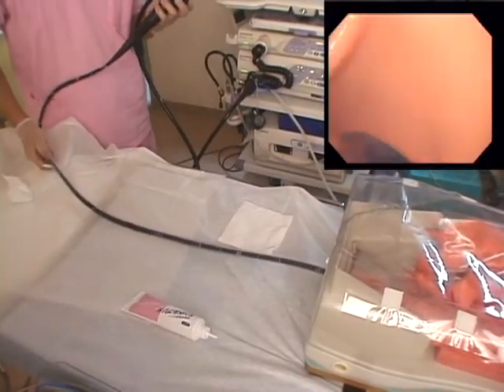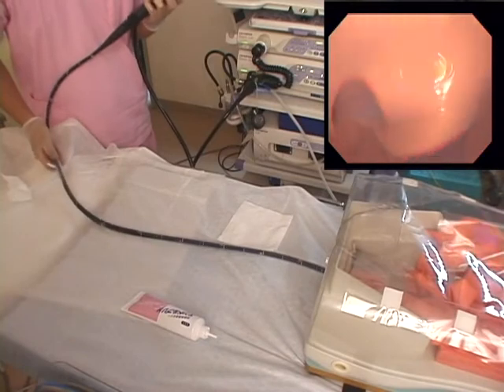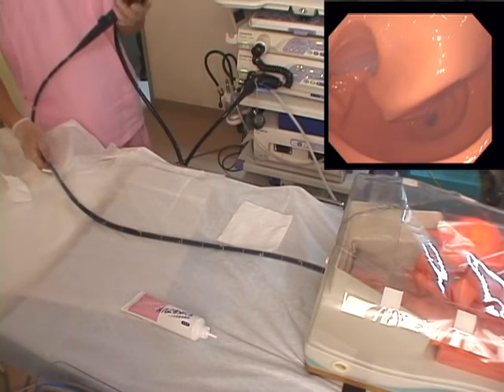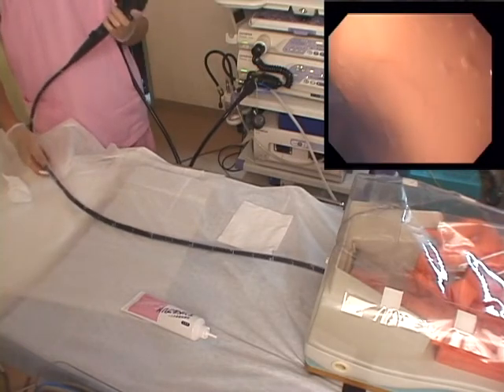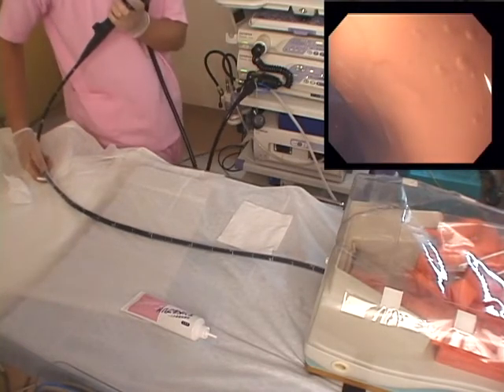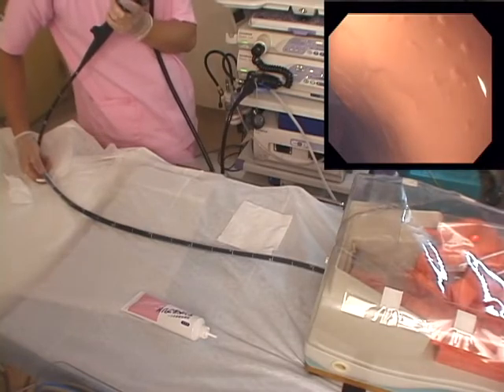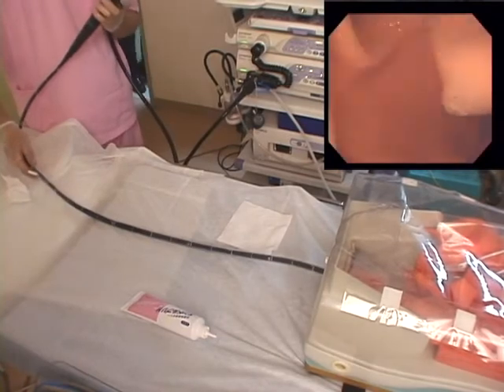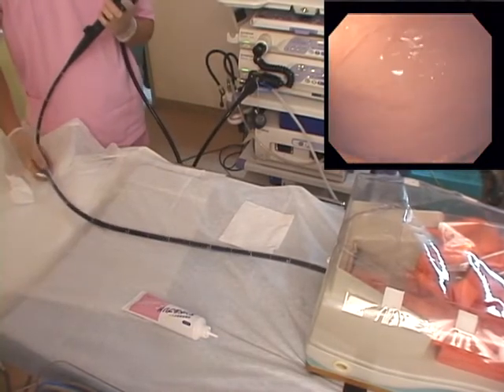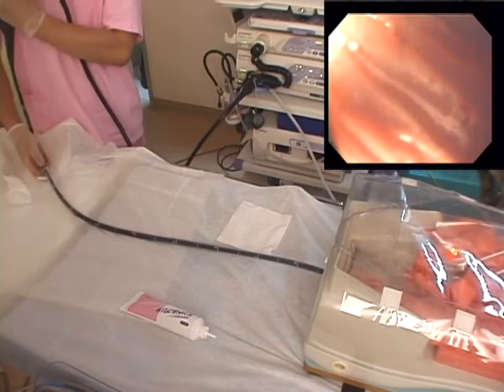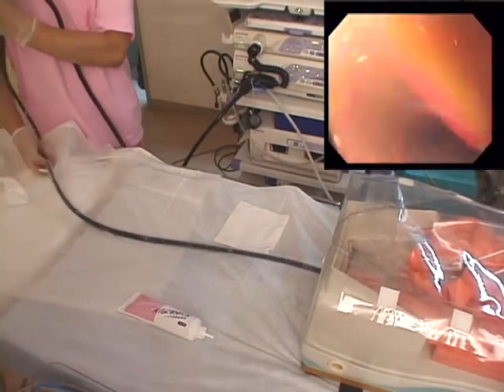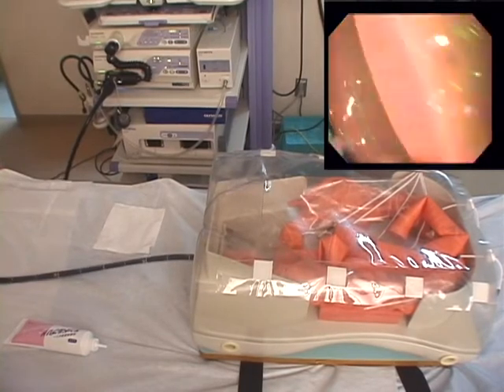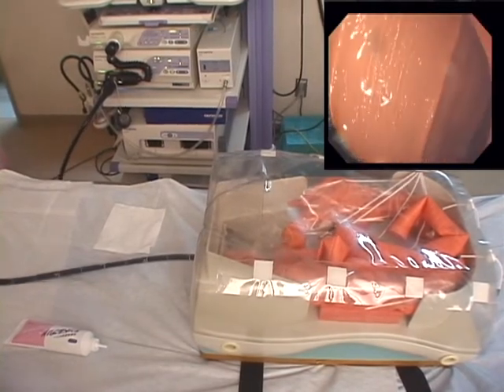Advance the scope to the rectum and sigmoid colon. As needed, move the fixation points with the SD flexure, splenic flexure, transverse colon, and hepatic flexure using the sliding tube balloon, and advance the scope and sliding tube to the ascending colon. Confirm the position of the ileocecal valve and advance the scope along the small intestine. Once beyond the ileocecal valve, advance the scope as far as possible into the small intestine.